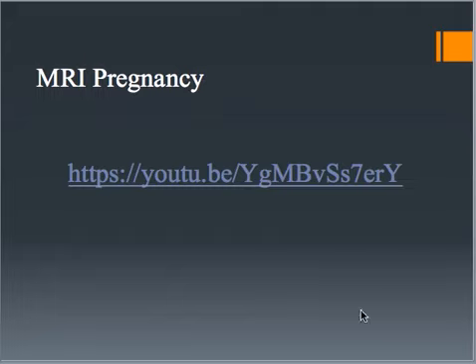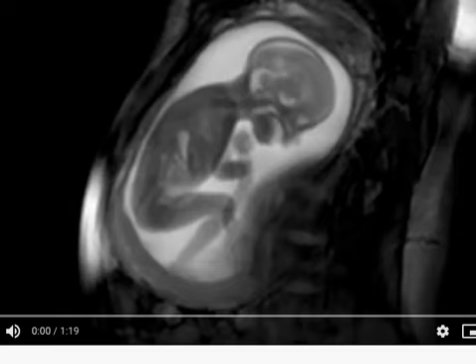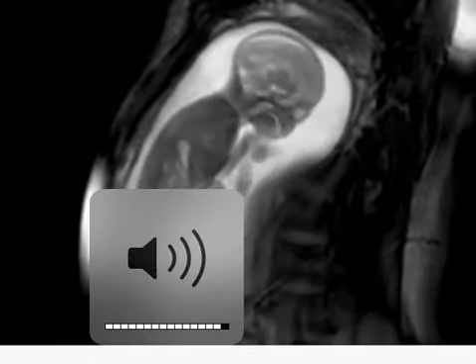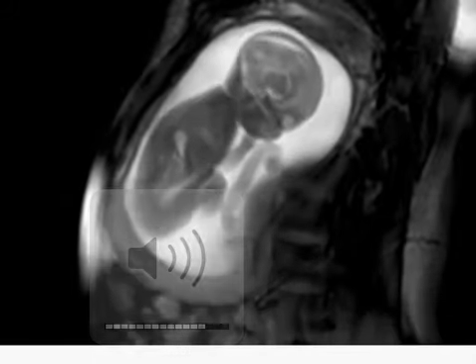That's kind of cool. I'm going to show you the video here in just a second. All right, let's go ahead and start this. So this is just the baby kind of moving around in the womb. Let me put some little music with it, sorry.